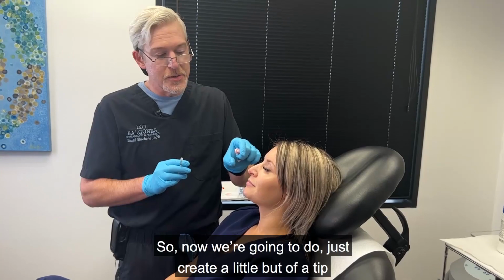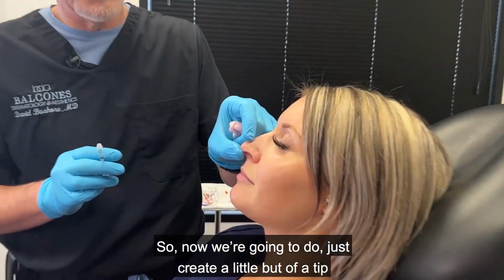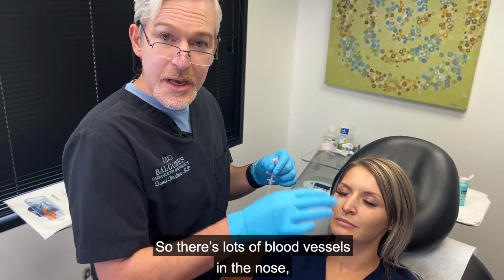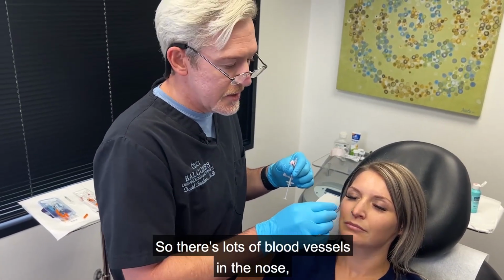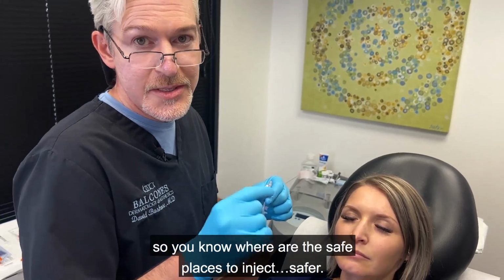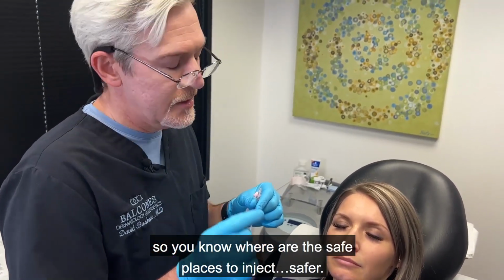So now we're going to just create a little bit of a tip for her here and try and move it back, just right back in here. So there's lots of blood vessels in the nose, and this is important for understanding anatomy, so you know where the safe places to inject, safer.